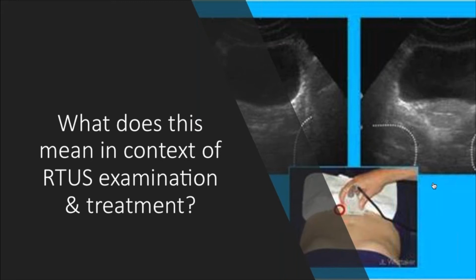So where ultrasound can be very helpful for us is getting a much better sense of how the pelvic floor is functioning as a whole, with breath, with activity of the surrounding muscles, including the hip musculature, and also use it to assess what's going on with the abdominals.